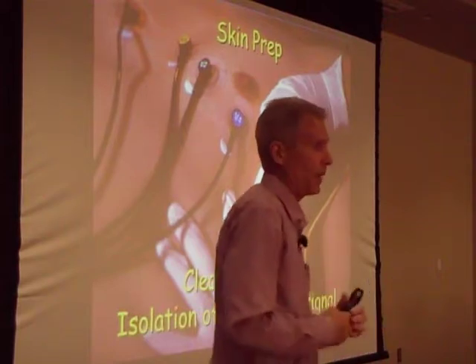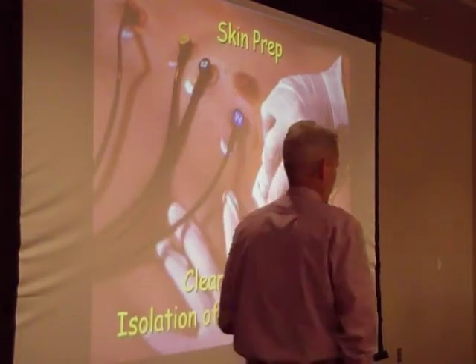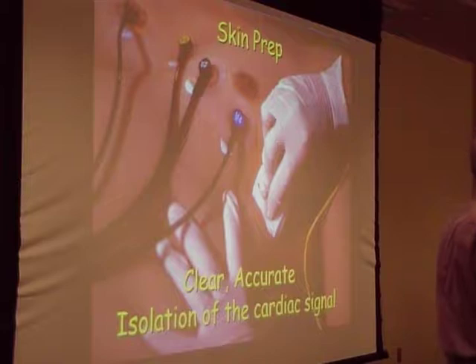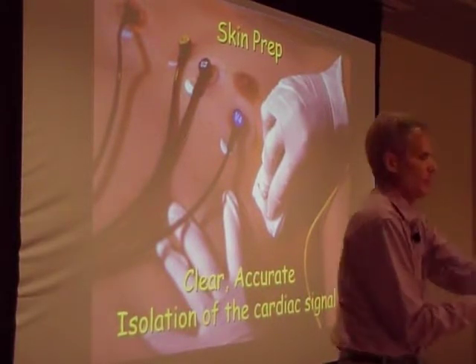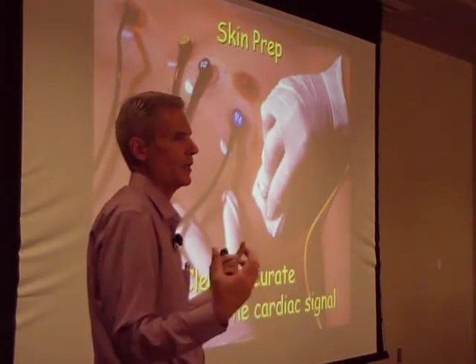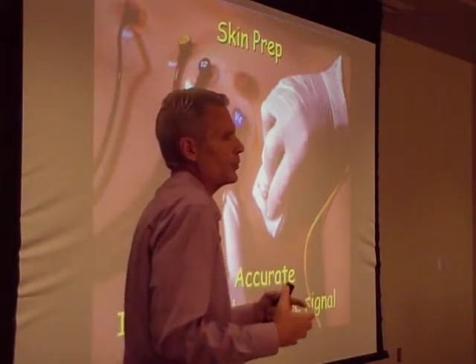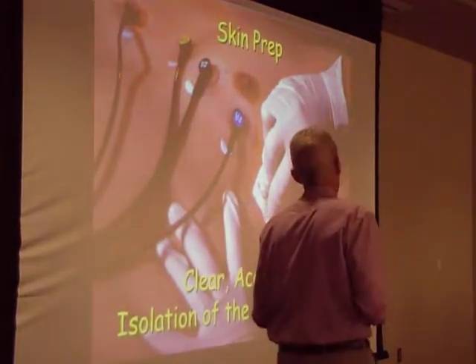And this is one of my pet peeves in the field. I don't think we go far enough when it comes to prepping the skin, in the pre-hospital setting as well as in a hospital setting. We're just basically plopping patches on patients, trying to capture a picture, and lo and behold, what happens? Those patches start to peel off. It reduces your ability to get a clear signal. If you spend the extra few seconds on prepping the skin, it's going to make your job much easier.